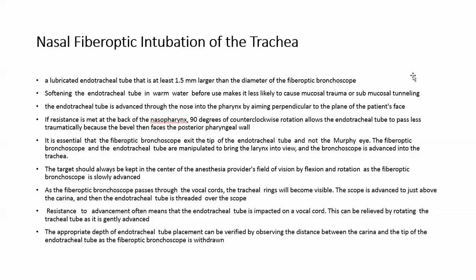The position is confirmed and the return of end-tidal CO2 is confirmed. The patient is anesthetized after confirmation of the correct placement of the endotracheal tube and the return of end-tidal CO2.